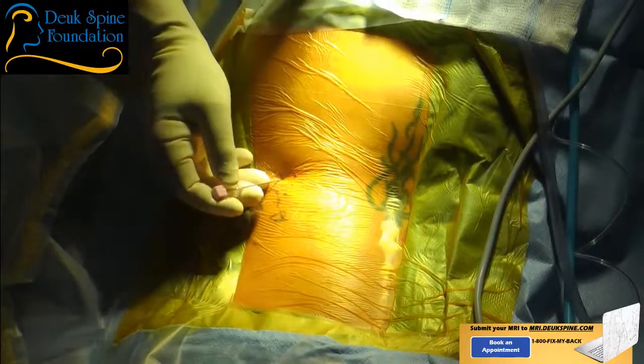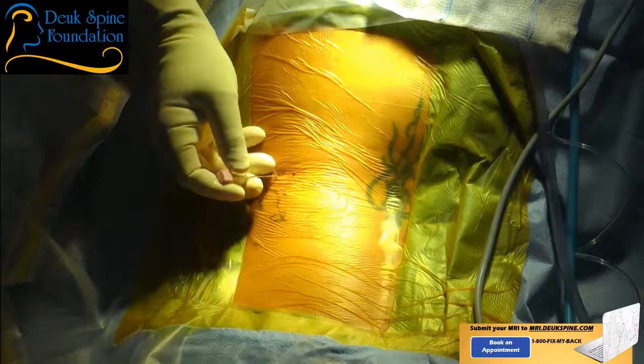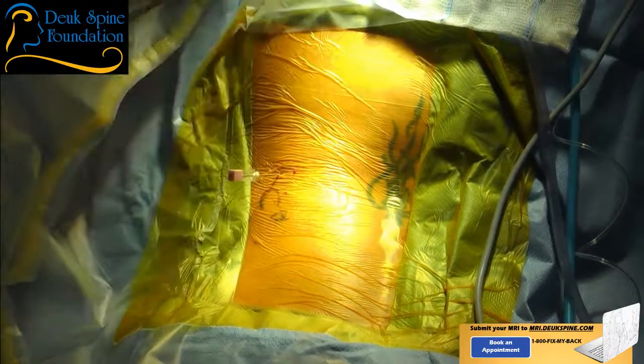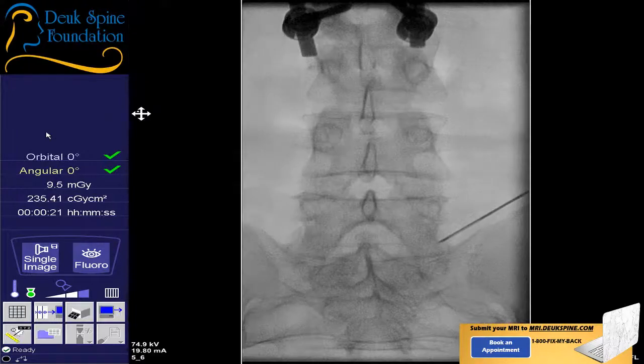Everything's okay. Shot. Where do you feel that? Give me an AP. What's she saying? Is it in your back or your leg? Your back. Okay, yeah, everything's fine. The butt too? Okay, not your leg. Back and butt. All right. It's perfect. Let's go back to a lateral, please. You're doing great. Everything's fine.